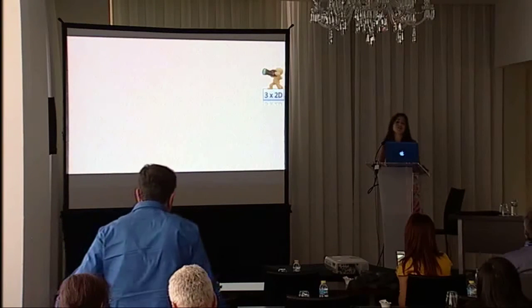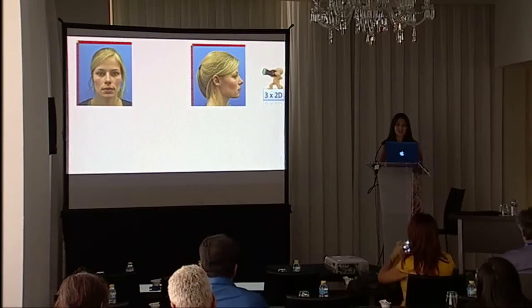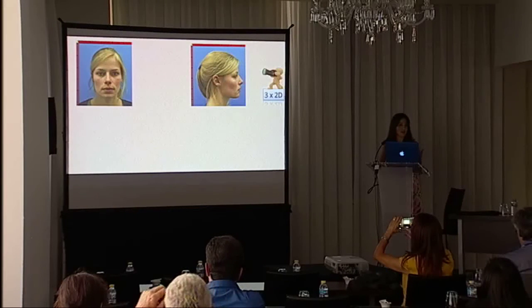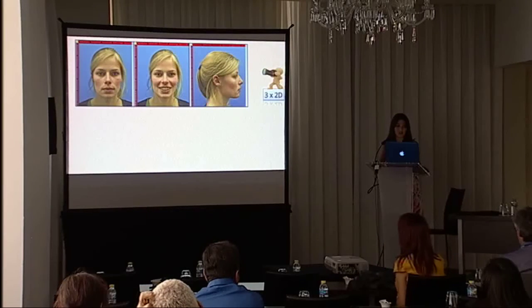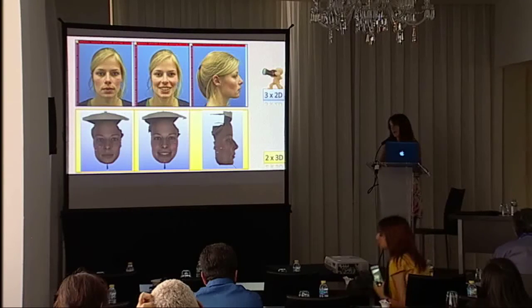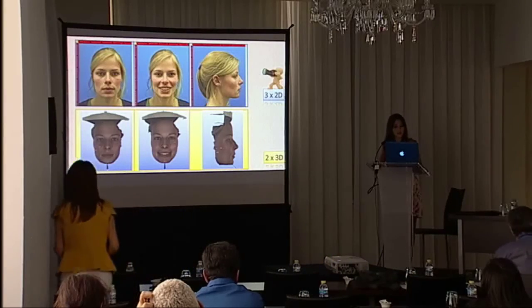So 3 classical photographs were taken for each of the subjects, 2 of which are non-smiling, 1 frontal and 1 lateral, and the last one is a frontal smiling. This setting has been done to imitate as much as possible the routinely taken photographs for orthodontic diagnosis. To match these 3 photographs, we had to take 2 facial scans, one of the smiling patient and the second one non-smiling.